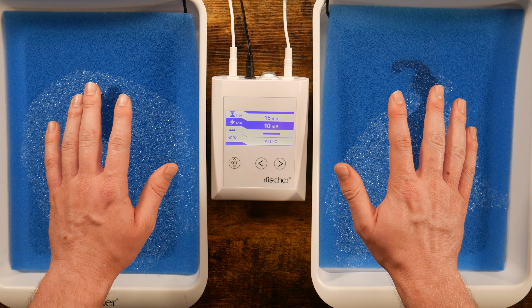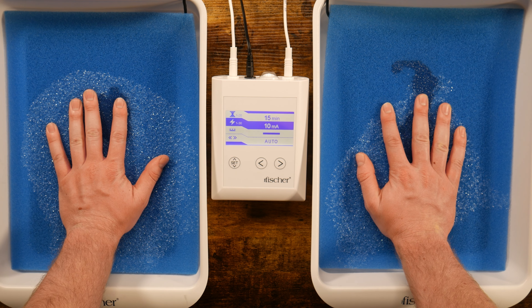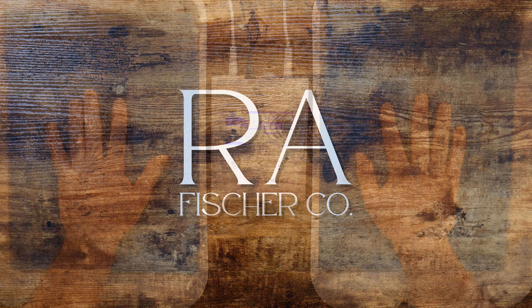Once you place your hands in the tray, the current will start automatically. That's it! Feel free to reach out to your treatment specialist with any questions.